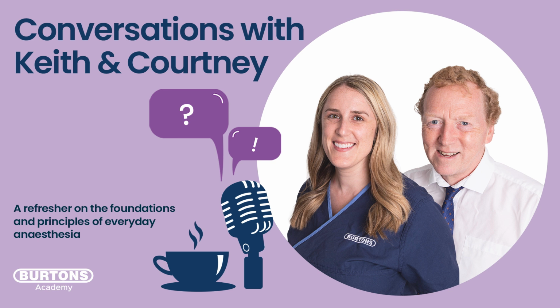And I know when we have our student nurses in the theatres as well, and they're doing a lot of scribing for us, and they're writing down all of the values on the anaesthetic record from the machine, sometimes they'll just write, and then they'll see that number that should be above 95, and they think, oh, I'll write that down, but actually let's start troubleshooting that.